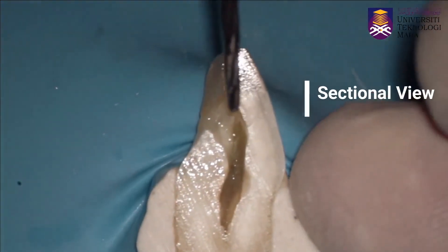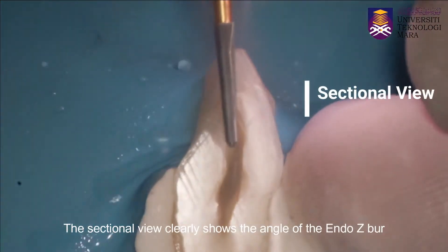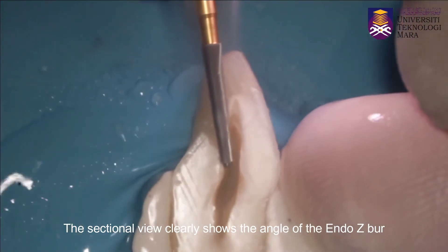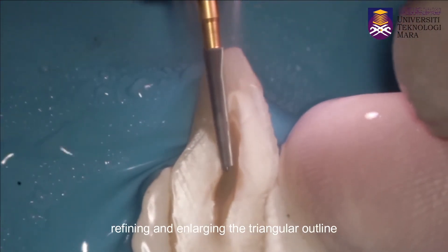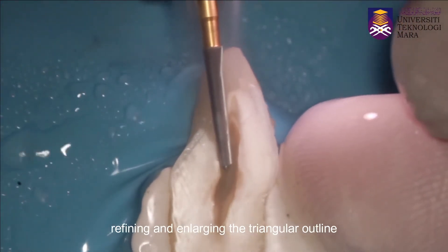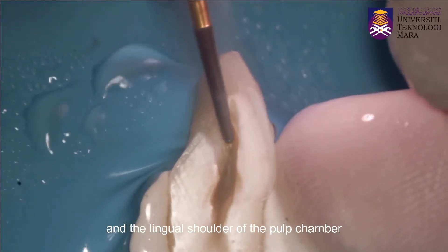The sectional view clearly shows the angle of the endoz burr refining and enlarging the triangular outline and the lingual shoulder of the pulp chamber.